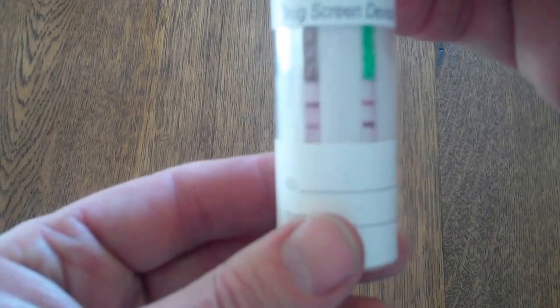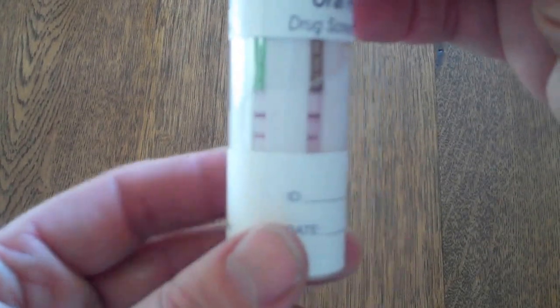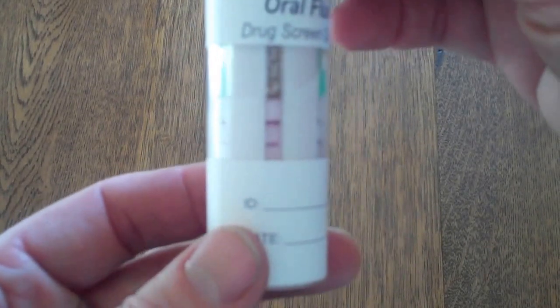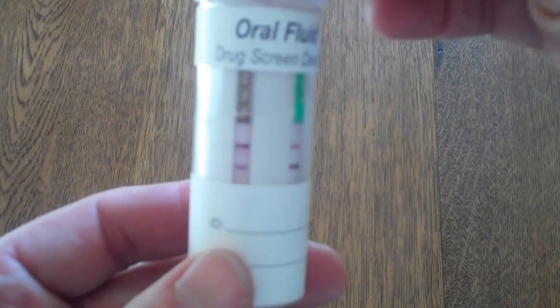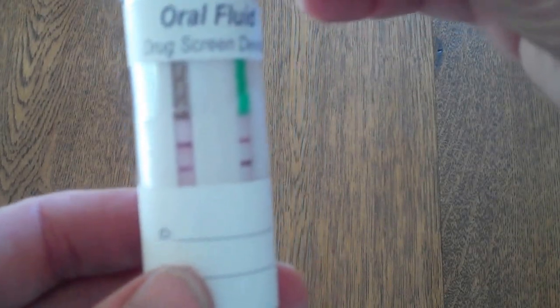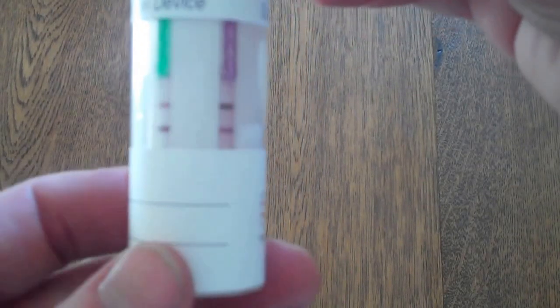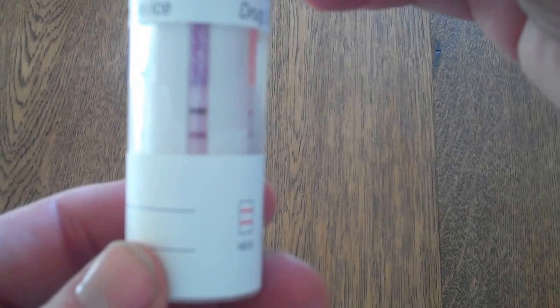If there was a positive test on this, then obviously it would need confirmation testing on the same sample to absolutely ensure that the results were 100% accurate.